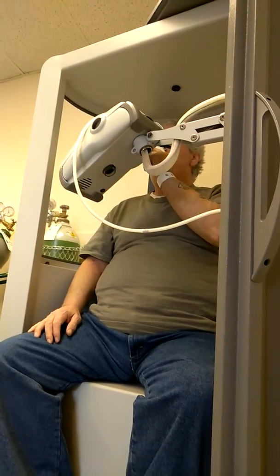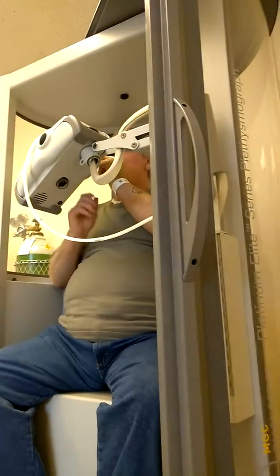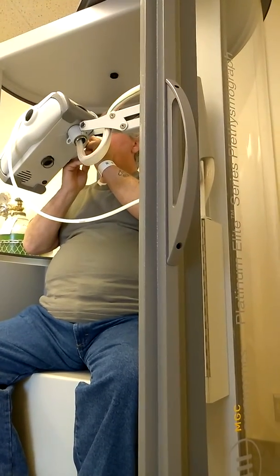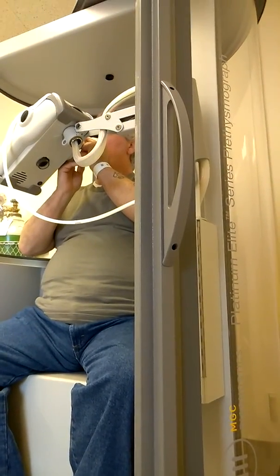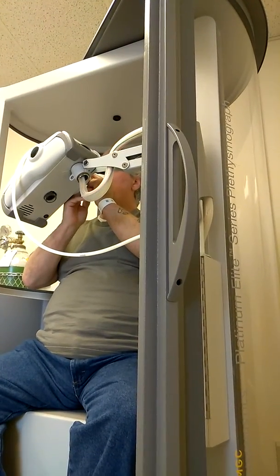Shoulder, chest breaths. Excellent. One more normal. Let it out, let it out — all the way, all the way, all the way. We're going to get ready here in just a second.